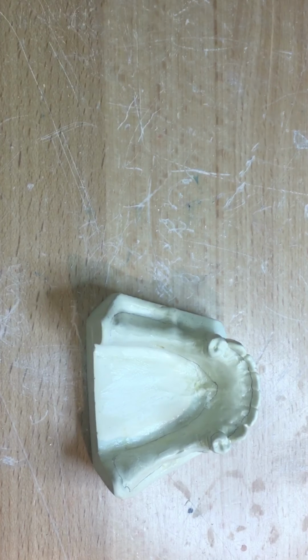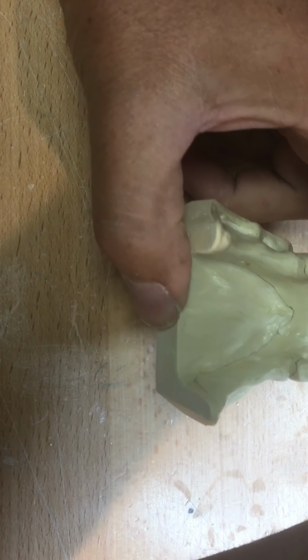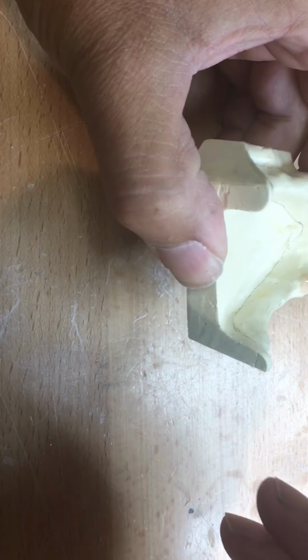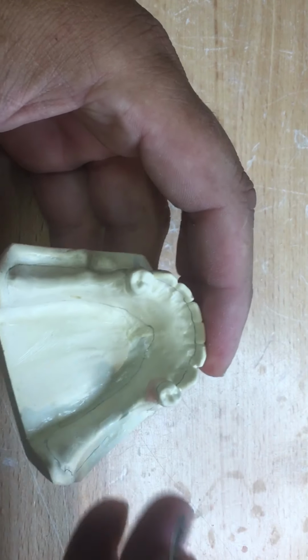So if you were to see undercuts on these natural teeth, then I would suggest to block them out. And you can block them out with a base plate wax. And just to experiment or show you, you've done this last year, you can just use some base plate wax without the use of a surveyor parallel to the path of insertion. You think you can use your visual perception.